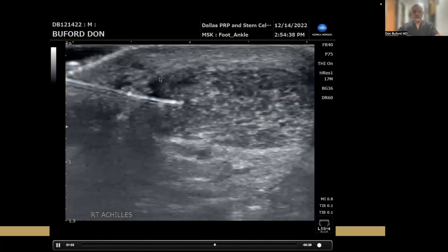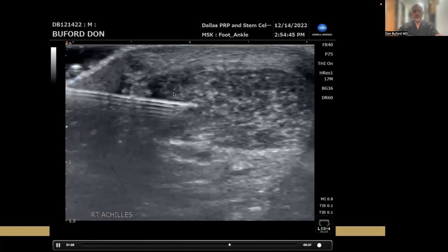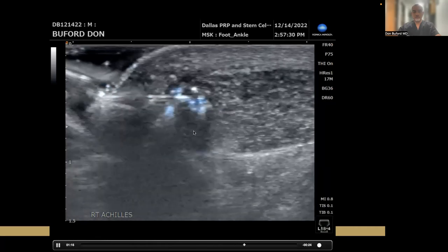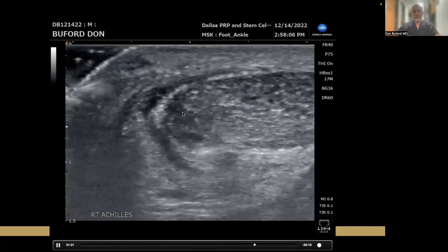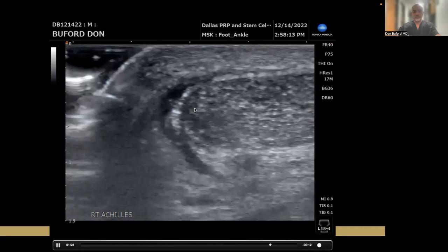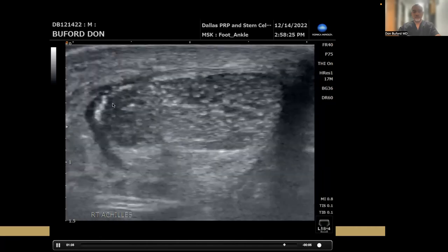You can see how well we can see the needle — it's just a short 25-gauge needle, nothing special about it. We're needling the hypoechoic region of this tendon, and then we'll go ahead and inject. Once we inject, you'll see some hypoechoic signal change that represents the PRP that we just injected. Now we've injected, and you can even see some fluid around the tendon here — that's PRP.